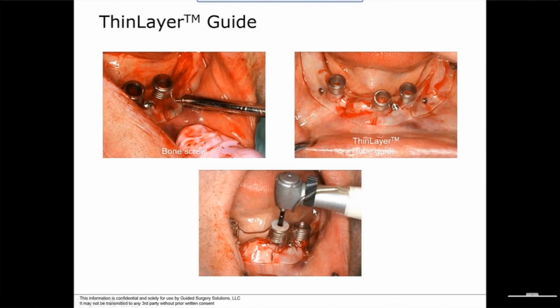the incision, the flap edges will retract and your drill will not cut the flap edges, because I was looking for primary closure. So within limits, it's a very nice technique, so you can flap it first, then bolt the guide down on it, drill through the incision, and you will not tear up the edges of your flap.